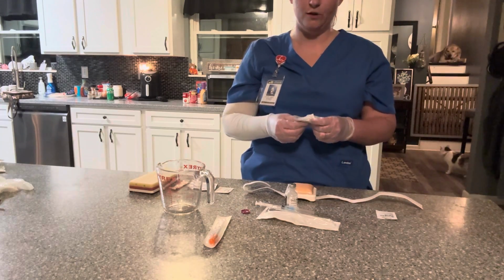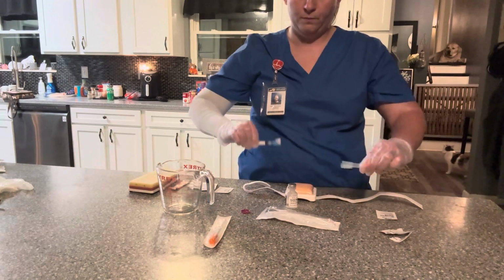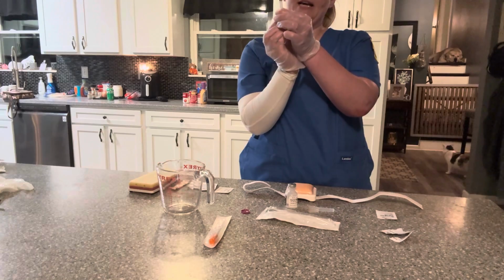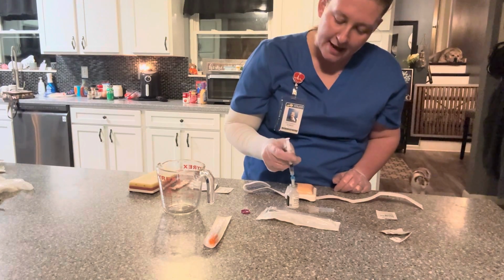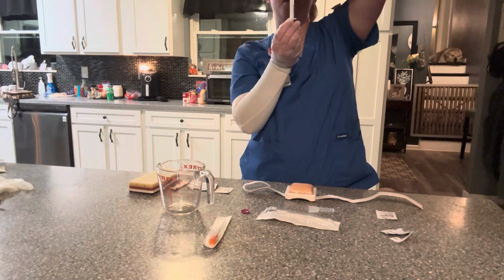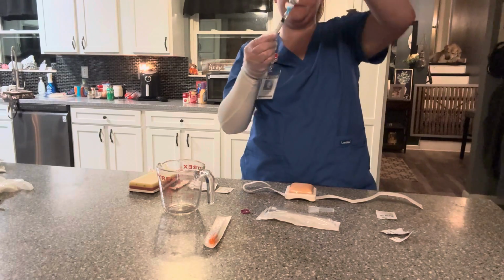Before injecting the needle, I will cleanse my vial, pull off the cap, draw up the correct amount of air for the amount of medication that I'm going to administer. Inject air into the vial. Pull up the correct amount of medication, making sure there's no air bubbles in the syringe.